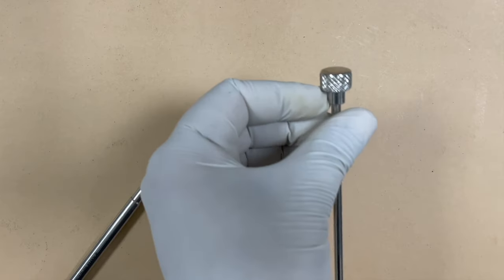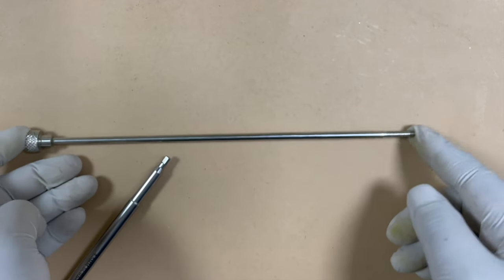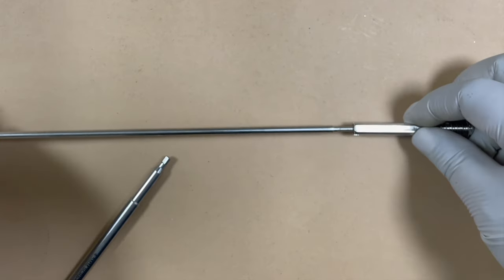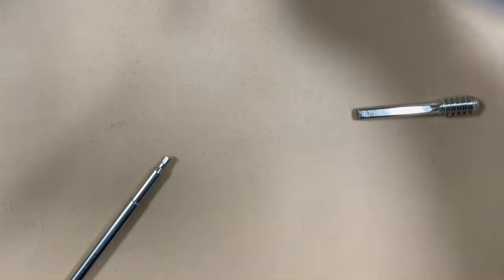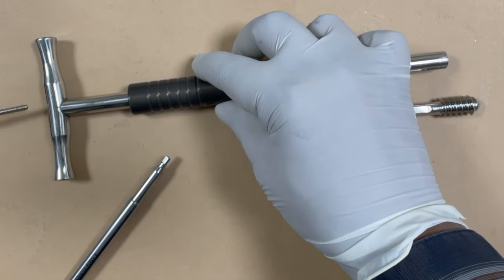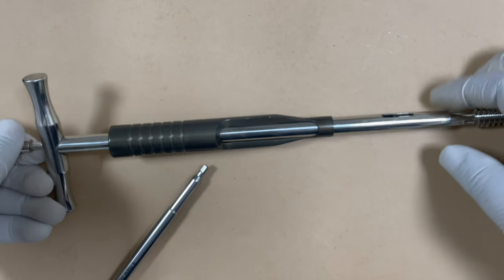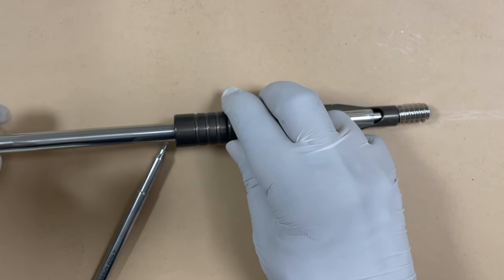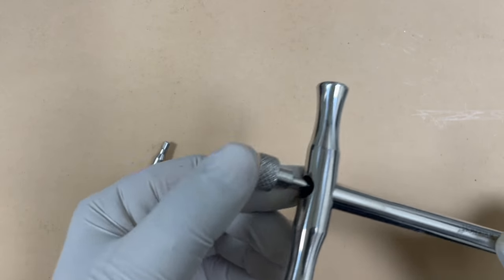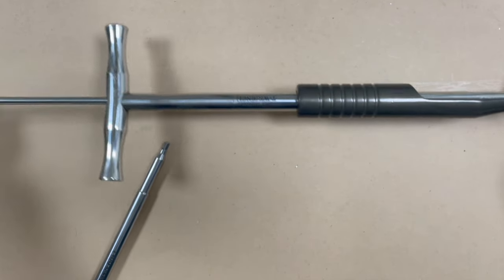There is often confusion about this non-cannulated device. It is not for insertion of the lag screw — it is for removal. It has threads that lock inside the lag screw. For the removal assembly, you use this device along with the sleeve and T-wrench, insert it inside the lag screw, and tighten it to gain hold. Rotating it allows you to pull and remove the lag screw. So for implant removal surgeries this non-cannulated coupling device is used to engage the threads of the lag screw.